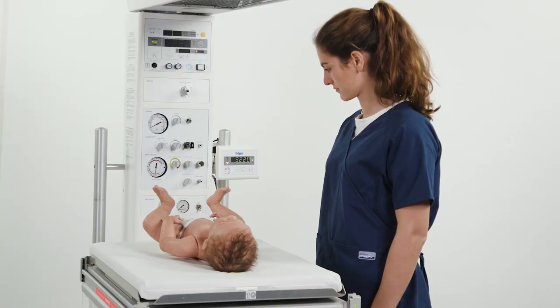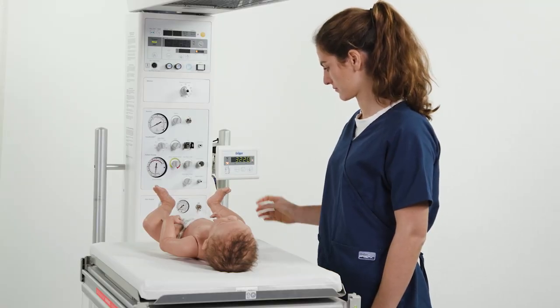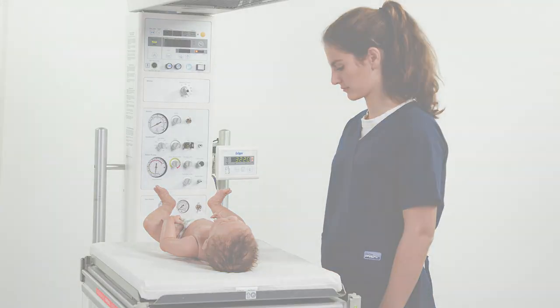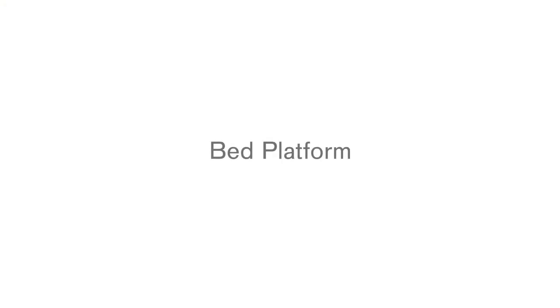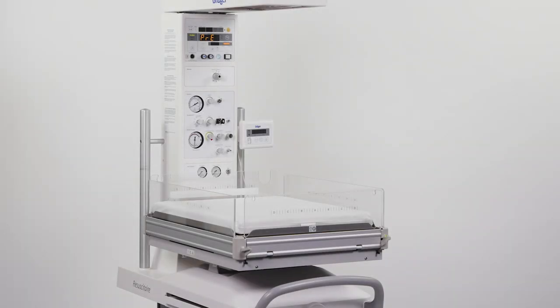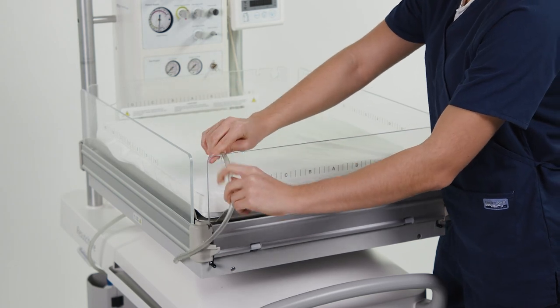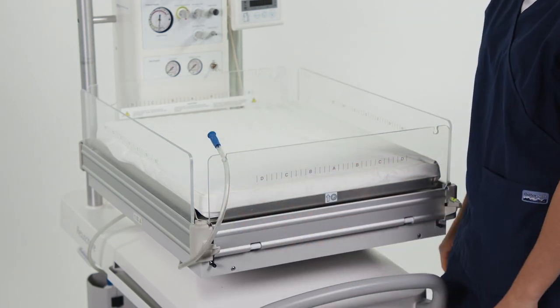To reweigh the infant without removing or adding anything to the bed, press the reweigh button. The optional scale can measure the neonate's weight without having to place the baby on a separate scale. The suction tubing can be placed into the appropriate cutout in the side panel.